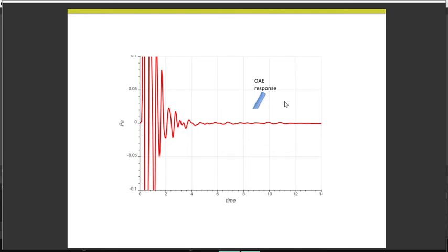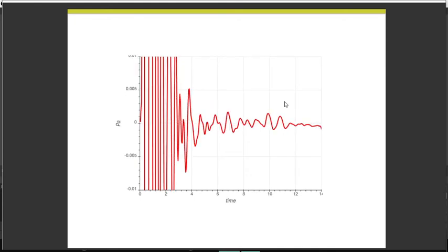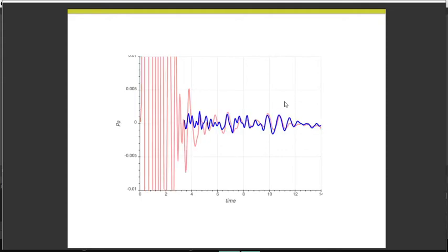It's enormous. And we're beginning to see some little details in that waveform at 6, 7, 8, 10 milliseconds. That is the OAE response beginning to show up. I'll amplify some more and some more, and now we've got clearly an OAE that's present, up to 10 milliseconds there. Where does it start? We can't tell because we've zoomed in so much on the stimulus that it's unclear where the stimulus ends and the response starts.